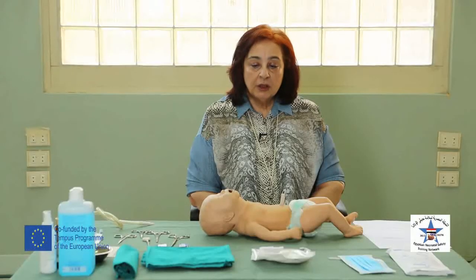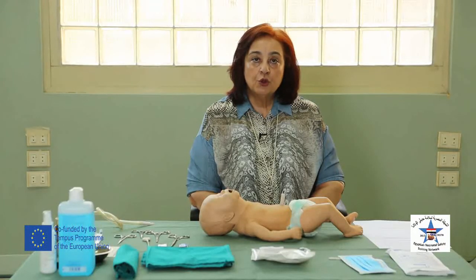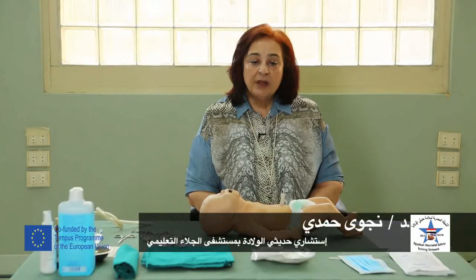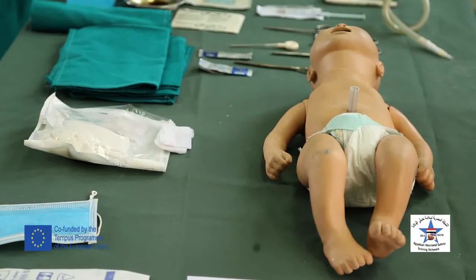We'll be demonstrating the chest tube insertion procedure. Most of the time, the needle aspiration will be followed by a chest tube insertion. There are certain precautions to be taken before performing this procedure in babies with coagulation disorders, bleeding disorders, or severe thrombocytopenia. We should treat these conditions either before or during the performance of the procedure.